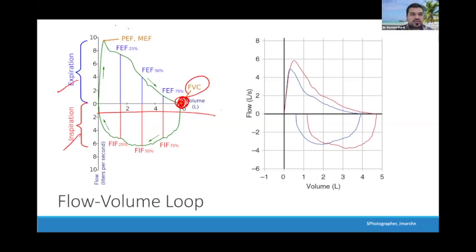You're going to know how much this child exhaled maximally in his forced vital capacity. And then usually we'll look at the peak expiratory flow. So that's how quickly was the maximal flow rate that he was able to achieve, and that's usually within, again, the first second. So this is a matter of pattern recognition. You'll know that there are abnormal patterns that you'll just have to recognize, and we'll go through a couple of them now.